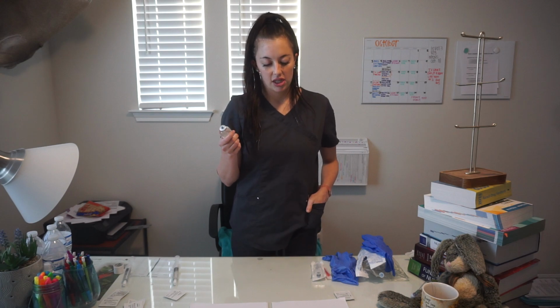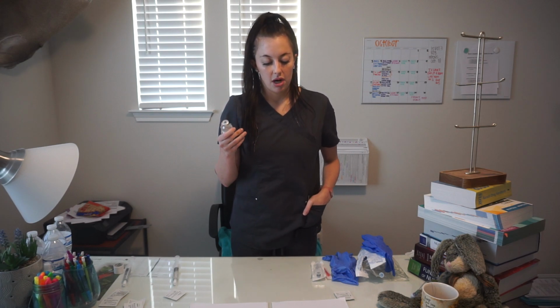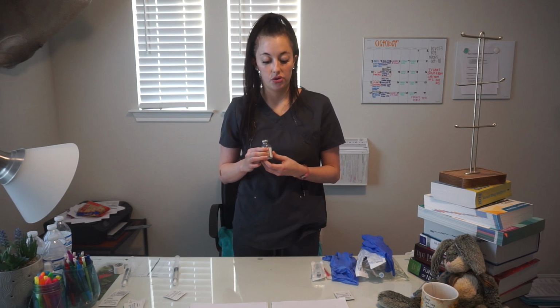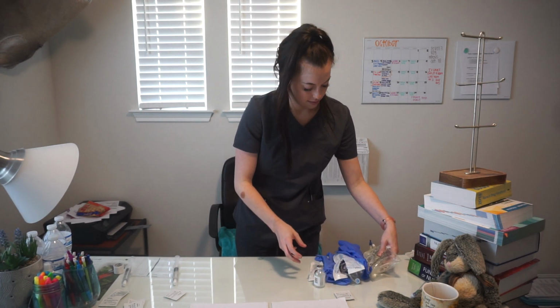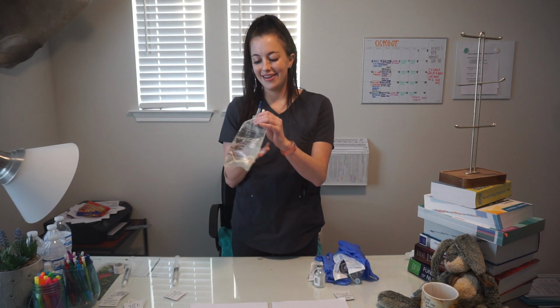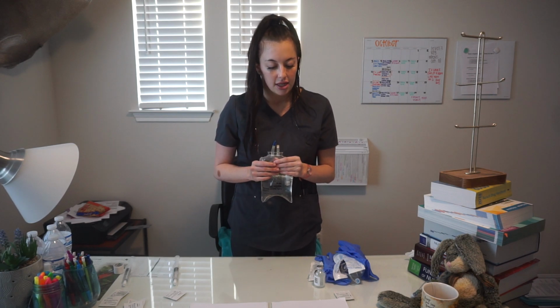Some adverse effects are dizziness, nausea, and possible somnolence. So I'm going to monitor his blood pressure and keep the patient supine due to possible postural hypotension. The infusion rate is D5 half normal saline at 100 milliliters per hour.